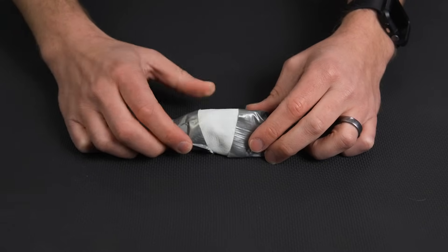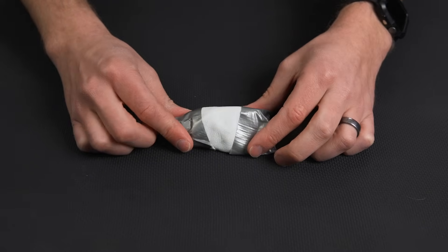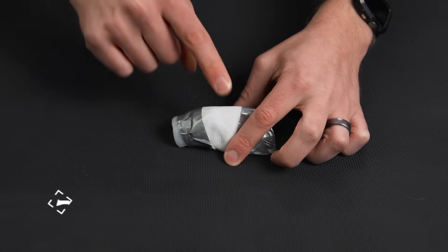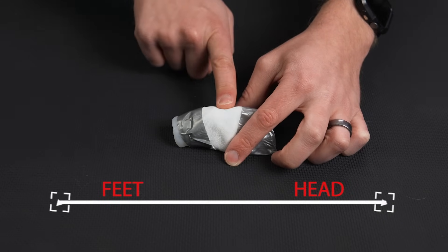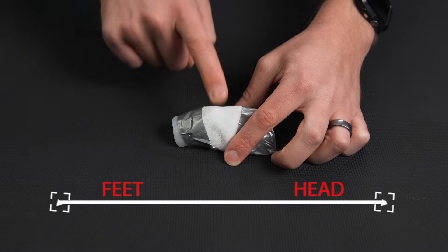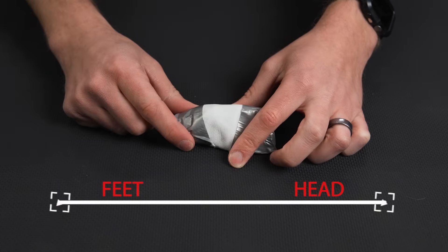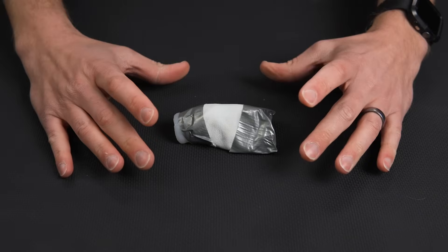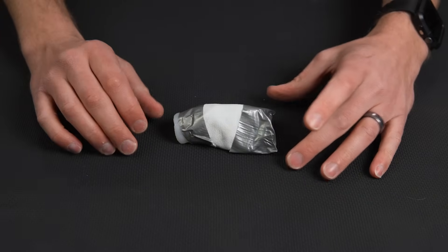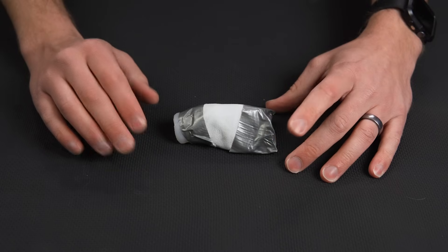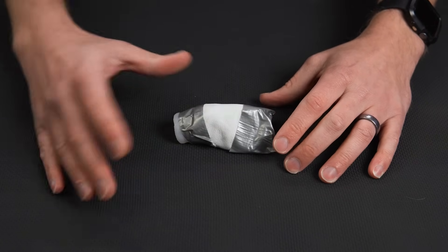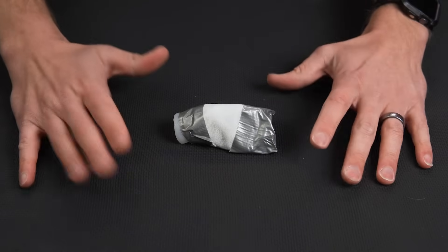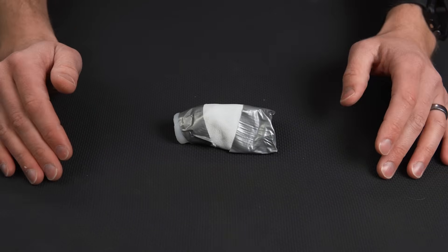So in true PrepMedic fashion, I have jury rigged this trainer with part of a leather glove to simulate the skin and then underneath that tape to simulate the actual membrane. The first technique we're going to do here is the traditional technique, what I was taught originally in school. And then the second one is a little bit more controversial and more new, but it's what I have been trained to do on the helicopter.